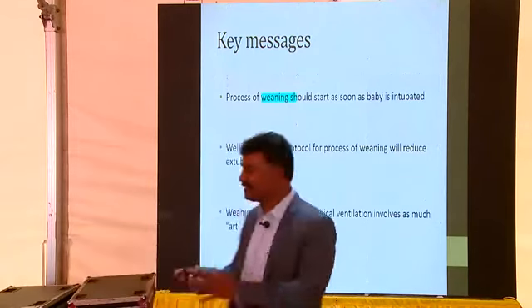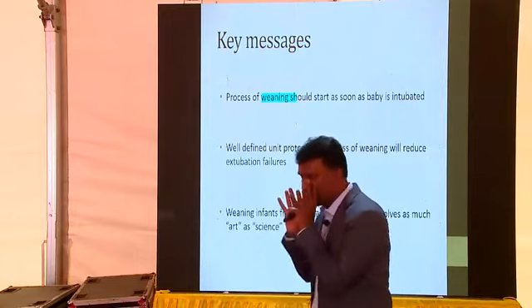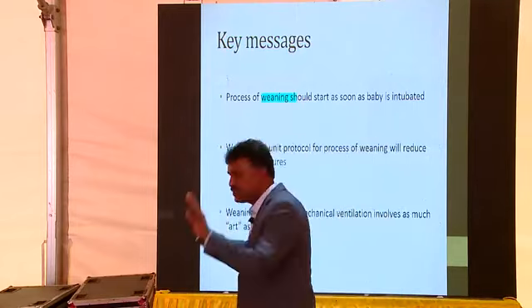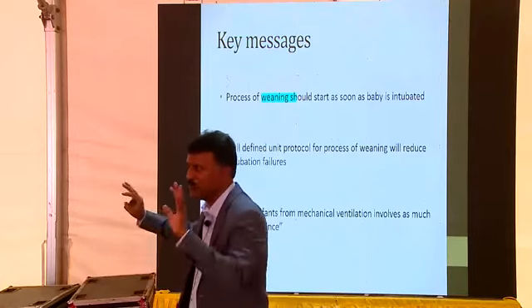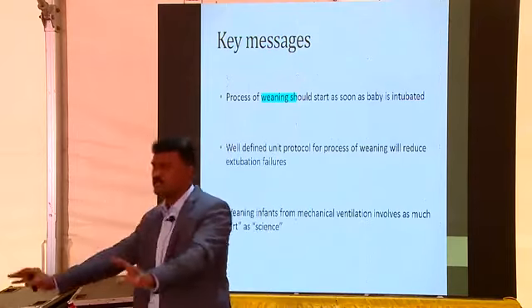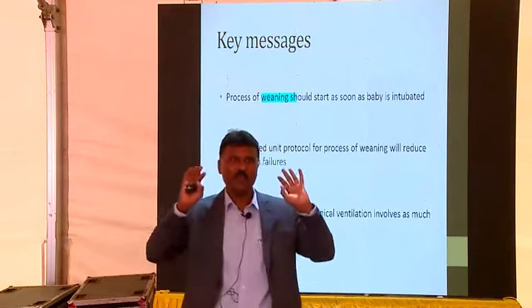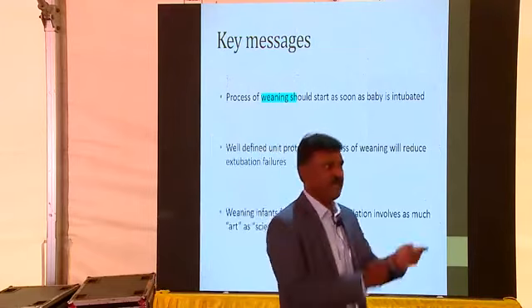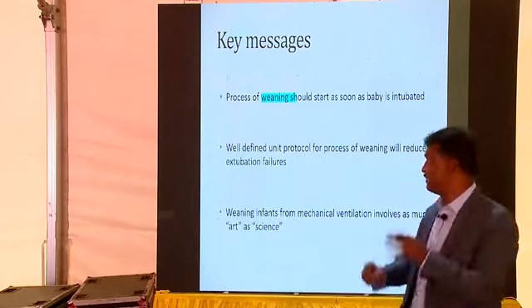The process of weaning should start as soon as the baby is ventilated. That is the first message I want all of you to take back. When should I start weaning? Somebody may ask you. My weaning will start the next minute I have intubated the baby.